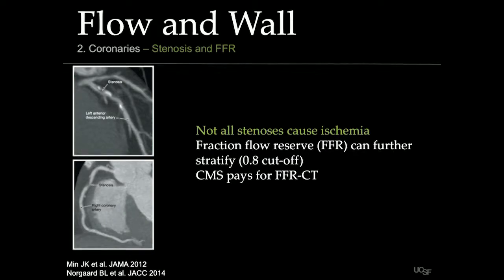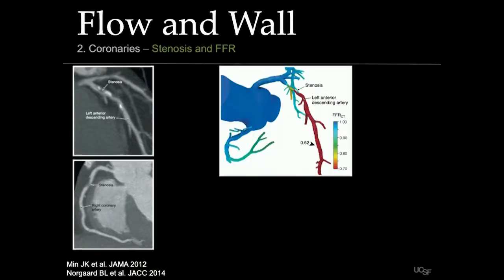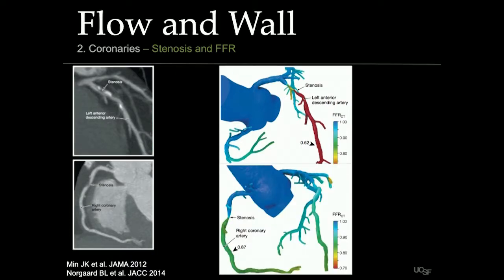So why is it compelling? Well, if you go back to our 2 cases, which conventionally would have to go to the cath lab, when you do the non-invasive analysis, in the first case, the FFR drop to 0.62 is significant. That patient should indeed go to the cath lab. Second case, though, a little bit surprising. It looks pretty bad on the CTA, but then when you look at the FFR analysis, not too bad, and you've saved this patient an invasive procedure.